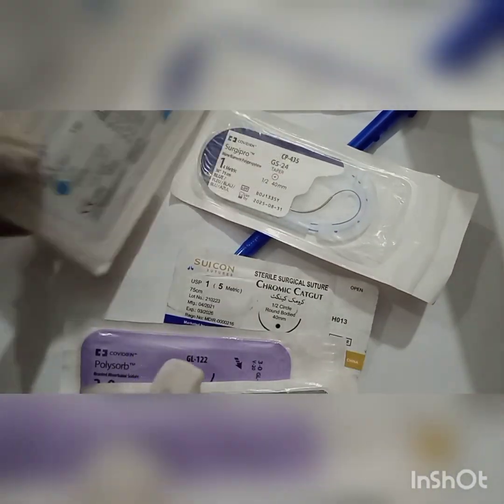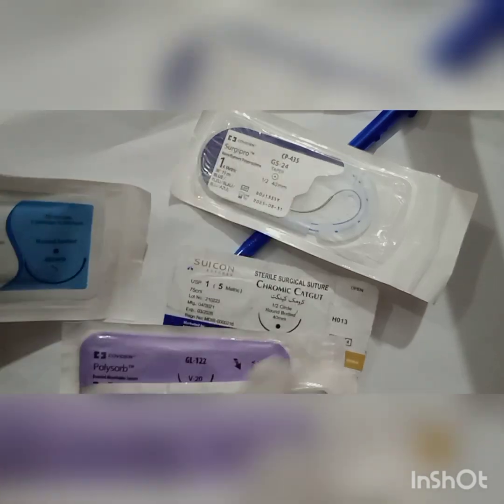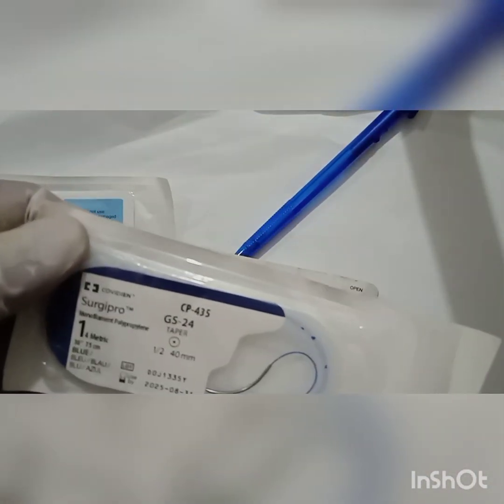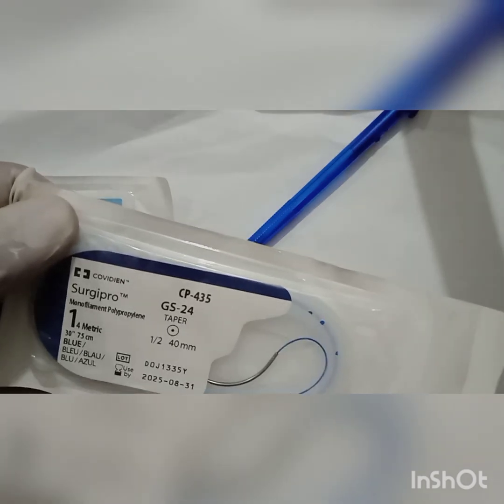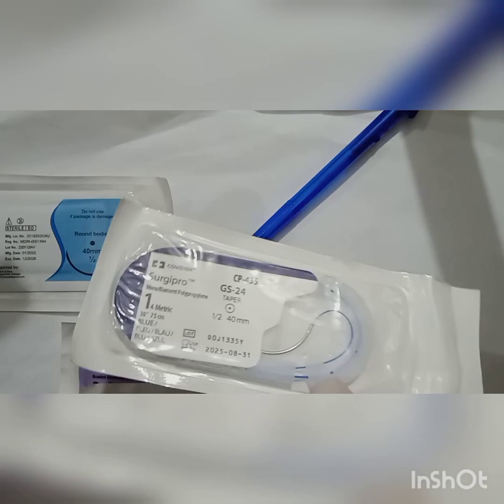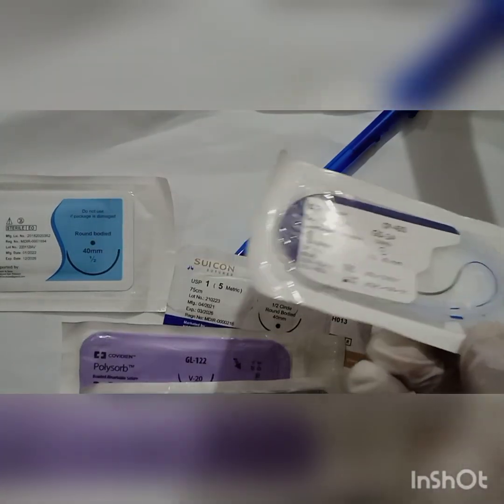While the monofilamentous ones, like polypropylene, are less reactive to tissue and less infective, less carcinogenic, less allergic. That's why they are more important.